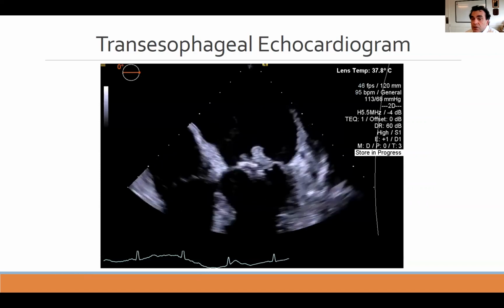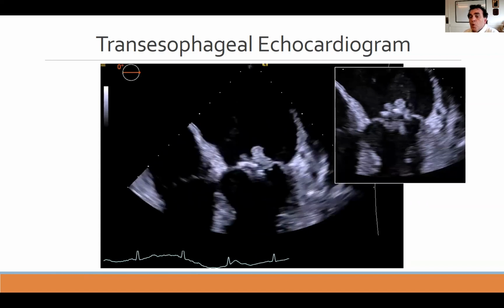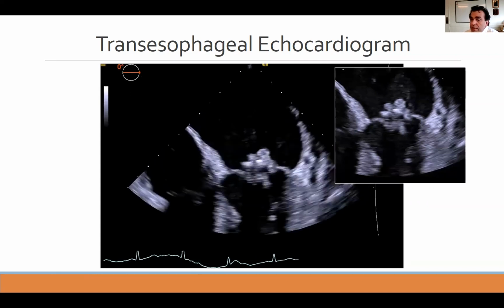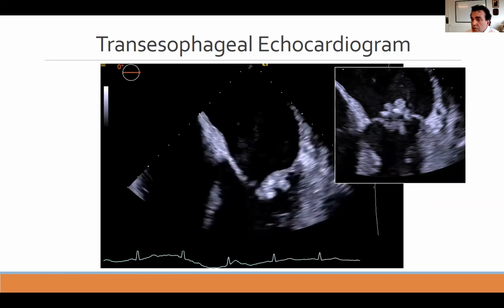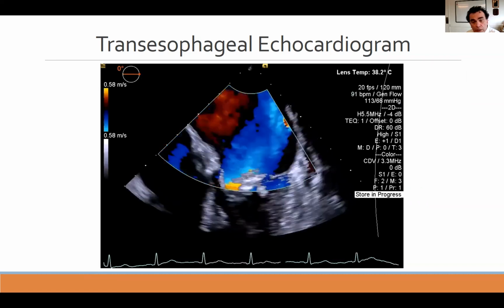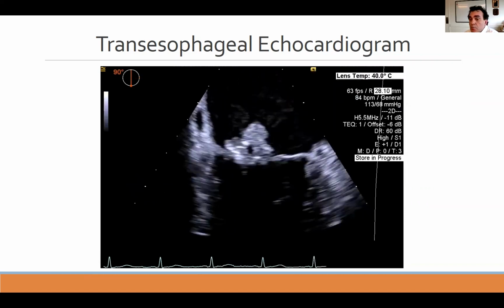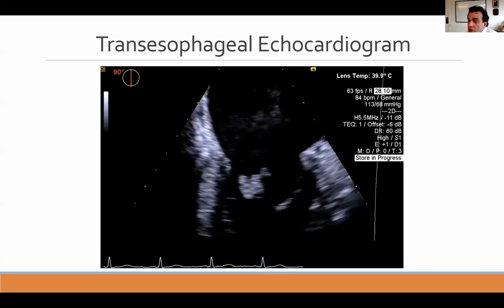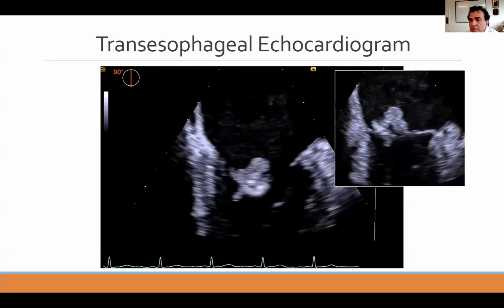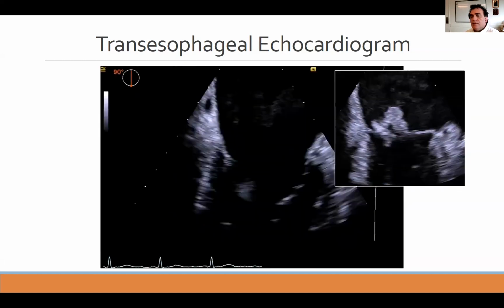The patient then underwent a transesophageal echocardiogram, and now you can better see these mobile echo densities associated with the mitral valve, particularly the posterior leaflet. If you turn the color on, you see there is significant mitral regurgitation, which we have already seen on transthoracic echocardiography. Now let's look again at this mobile echo density on the atrial side of the mitral valve. Let's freeze it and see the elements of this. You can see that there is a central lucency, that this vegetation is already cavitating.